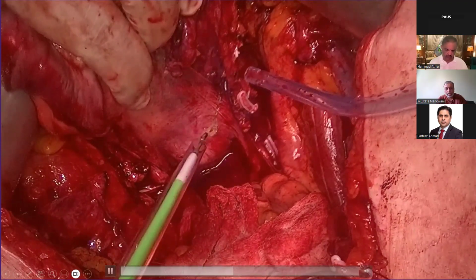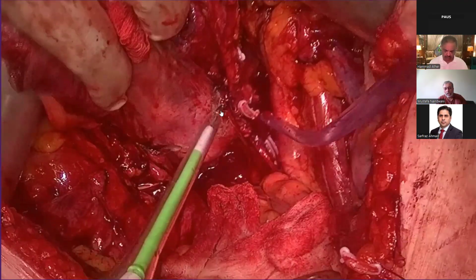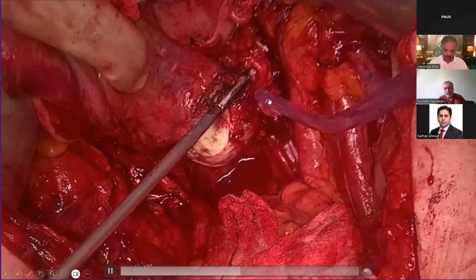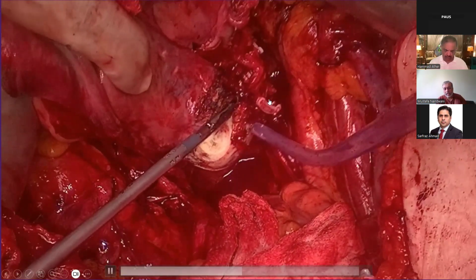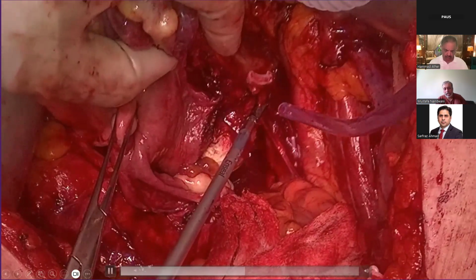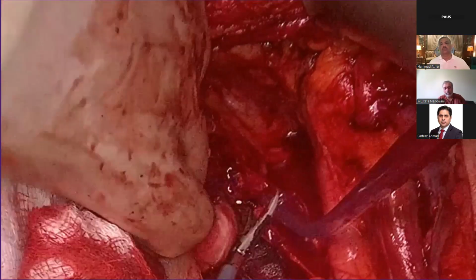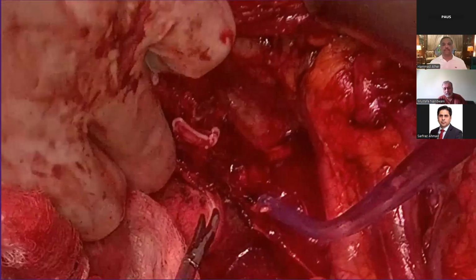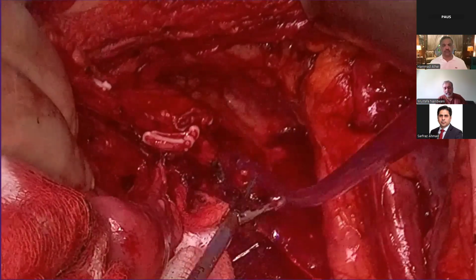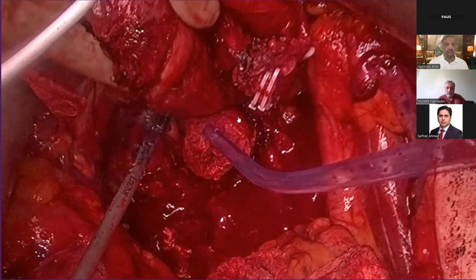When you cut it, then you can see the swab inside. This is the swab. Now this is safe, and then you cut it. So you see this area on the lateral side, which we need to go underneath and lift up, because in the female the tissues are lax due to previous childbirth, so these sag down. If you don't do this, you will leave the ureterovesical junction there, and that can turn into cancer later on. So both sides go side by side anteriorly.